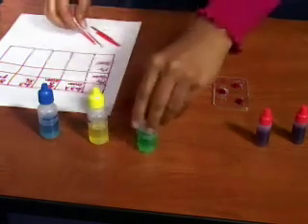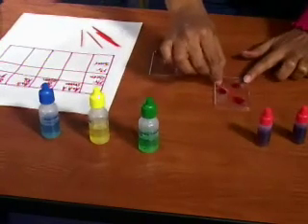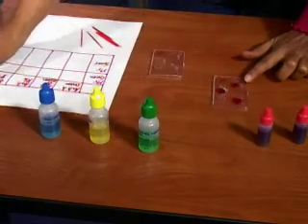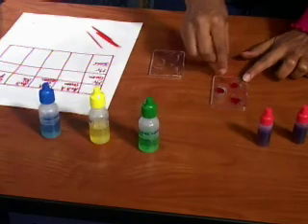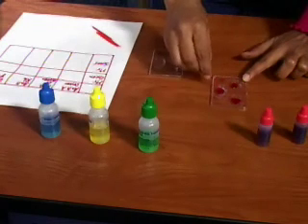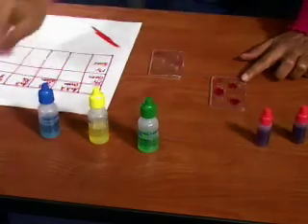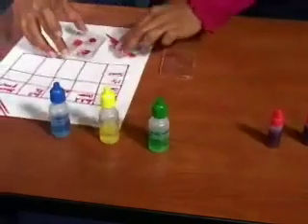I'm going to mix them, and I have to use separate sticks for each one. And I finally mix it with the anti-RH, and then I observe this to see if there is any agglutination.